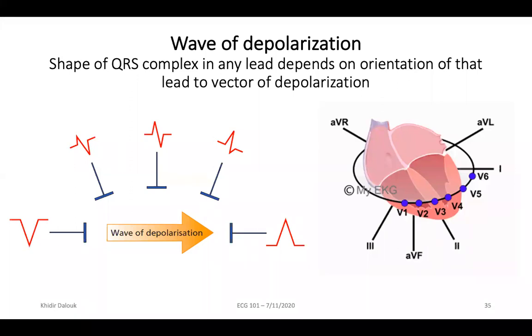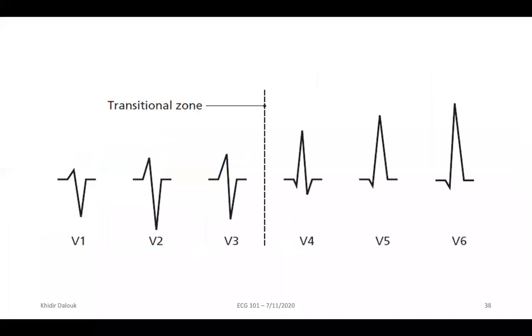If you see aVR being positive, it's either that this is a lead misplacement or this rhythm is originating from a different area rather than the sinus node.